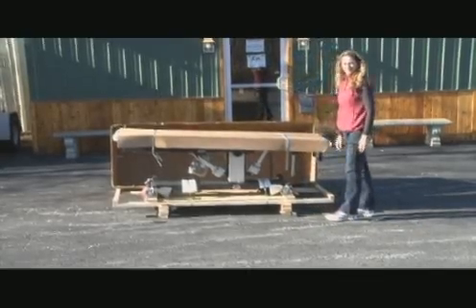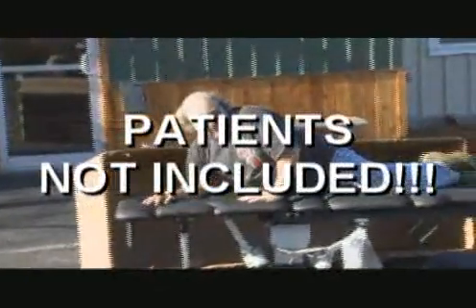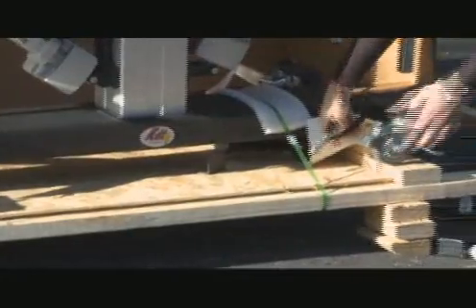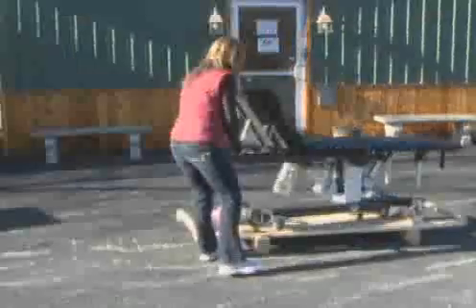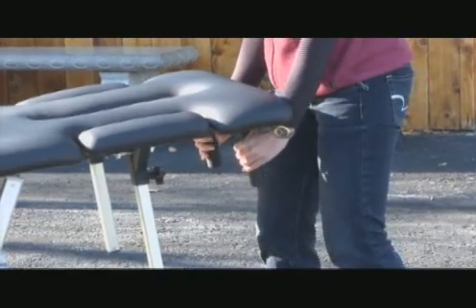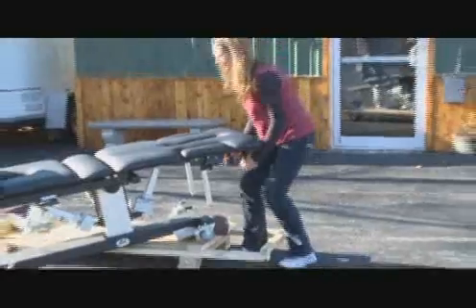Maybe you will be one of the lucky purchasers to receive your first new decompression patient with your NeuroFlex system. Use your cutters to clip the bands that hold the table to the inner crate. Elevate the cushion as shown and lift the table by the frame placing the wheels onto the ground. Lift the opposite end of the table and place the end of the table onto the ground.